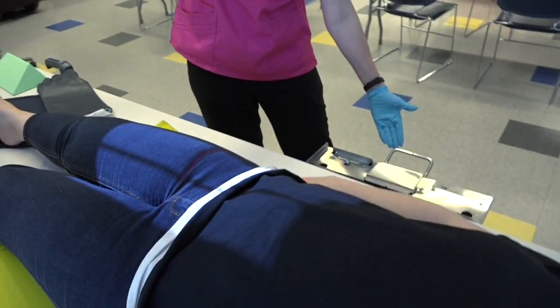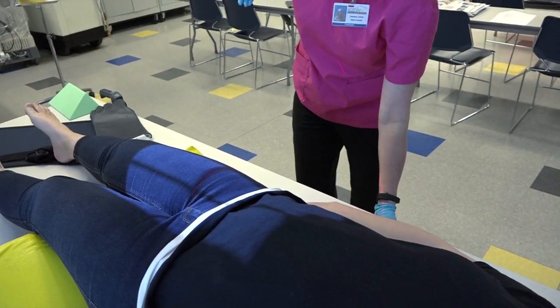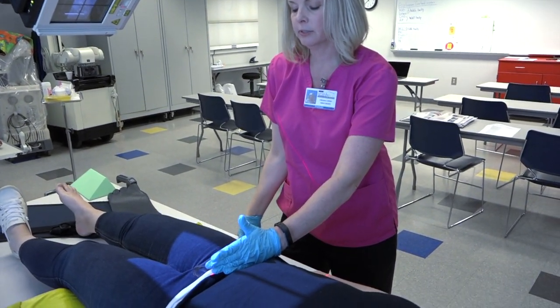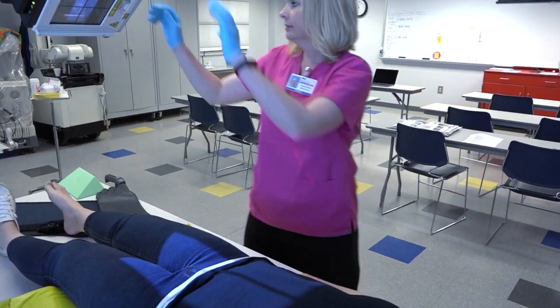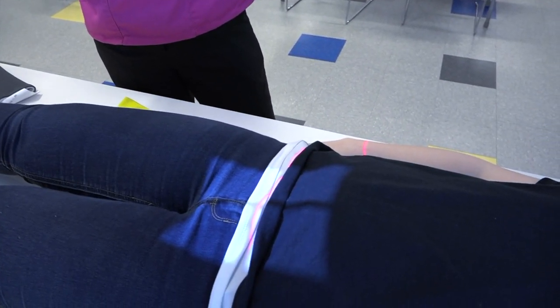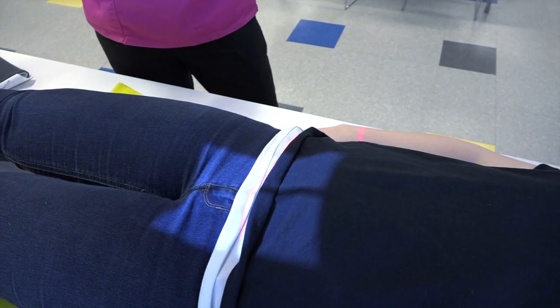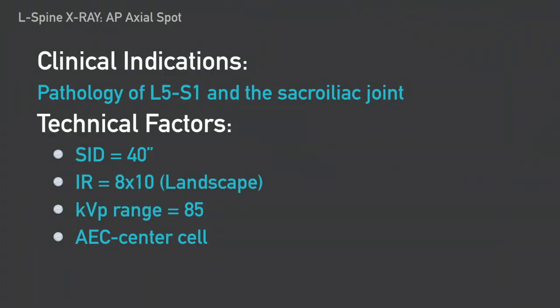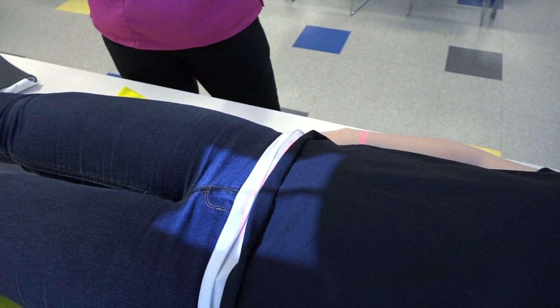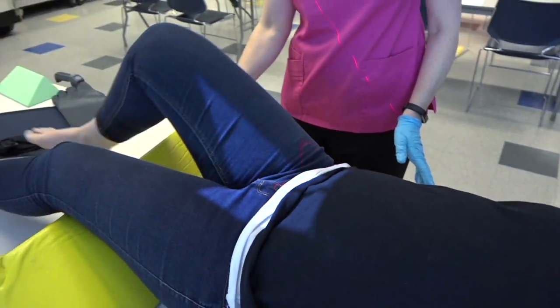With the angle, be sure to line up your tube and bucky. Then we'll position our patient in the mid-sagittal plane to the ASIS, and we'll collimate. So now we're going to roll over to our left side.